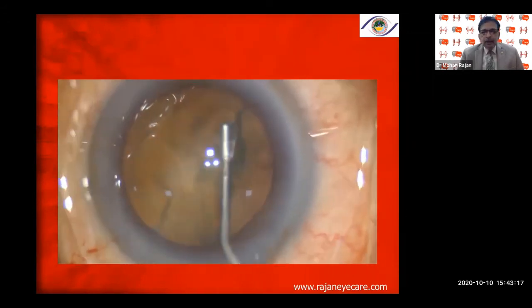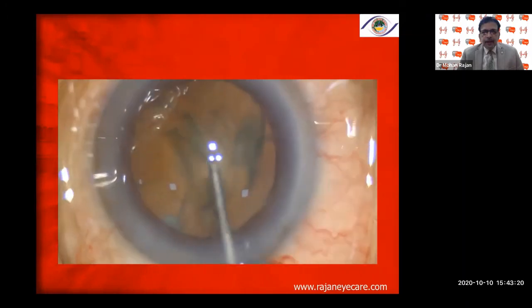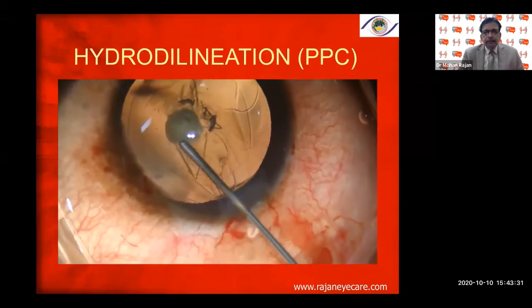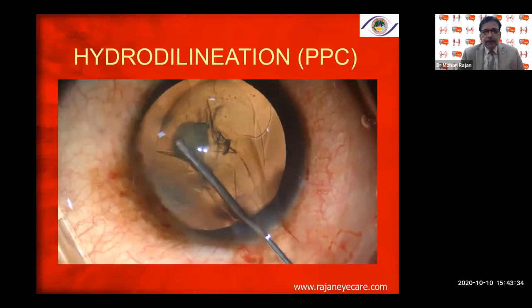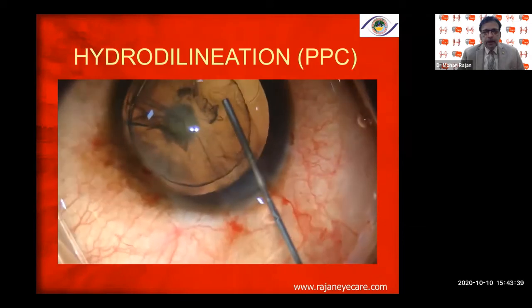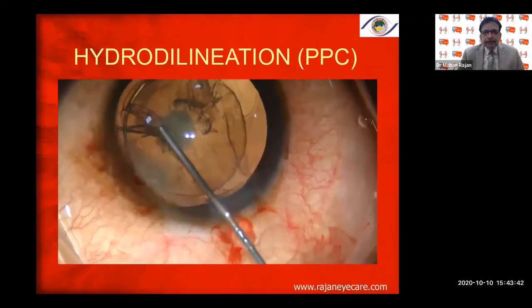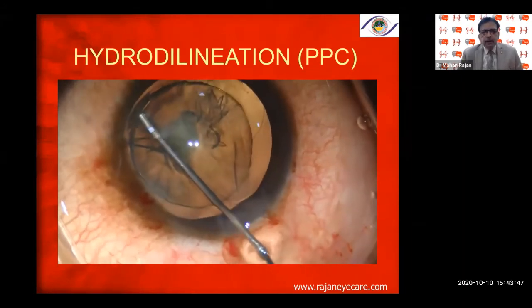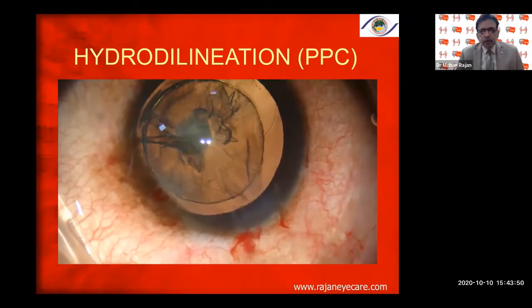If you keep injecting without decompressing, you can have hydro-rupture or acute capsular blowout syndrome. For hydrodelineation, I go at the junction of the nucleus and epinucleus — the endonucleus-epinucleus junction — and look for the golden ring. This is in a patient with a posterior polar cataract — a fairly soft cataract. I position the cannula carefully.